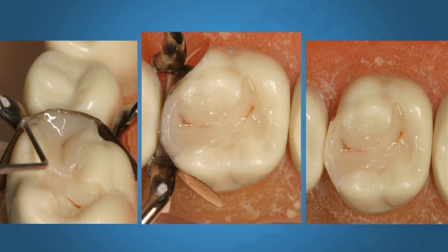It looks pretty close to finished, but if you look at the picture all the way to the right, you will see that there's some flash, interproximal flash. Of course, that's normal. We always have a little flash, even with a properly adapted matrix band. There will always be a tiny bit of flash cervically, proximally. How do we remove that flash?